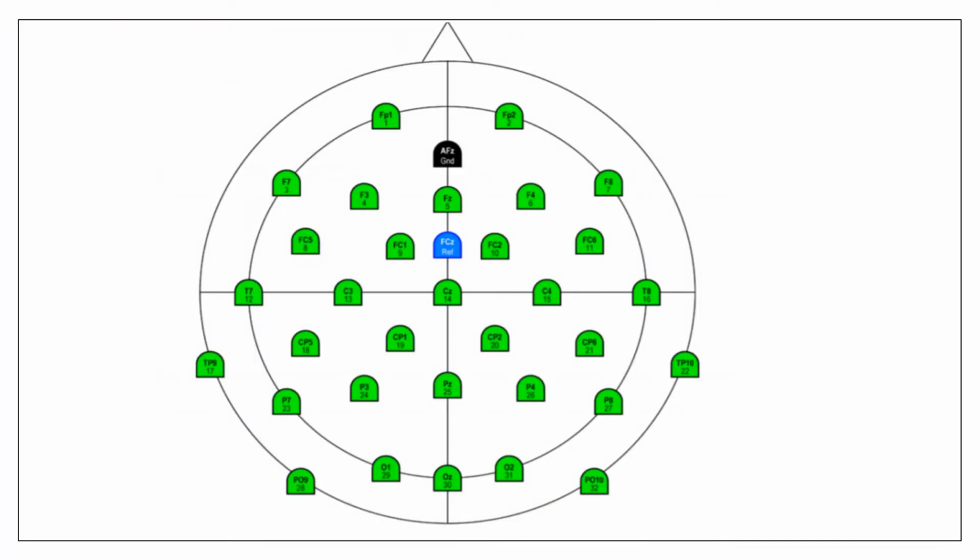Experiments that involve motor imagery often use the C3 and C4 electrodes and the reference and ground electrodes, which are the ones that are going to be used for this project. The subject will be asked to think of left and right movements, so we can distinguish these particular signals from other noise that might be generated. The acquired data will be used to implement a real-time BCI with the help of MATLAB, so the user can either trace a smooth curve through a given path or select the intended word by thinking left or right.